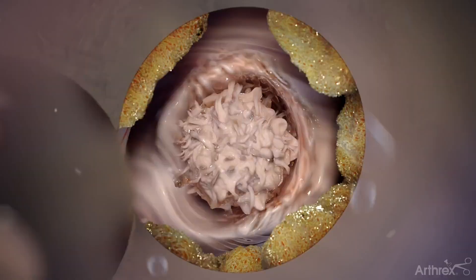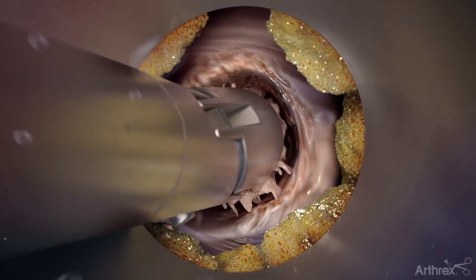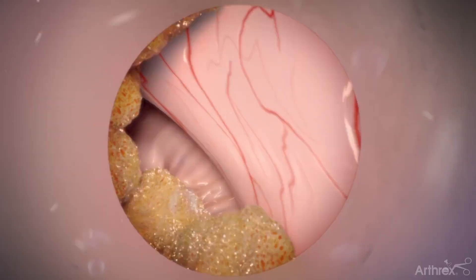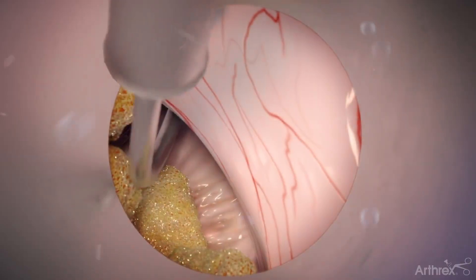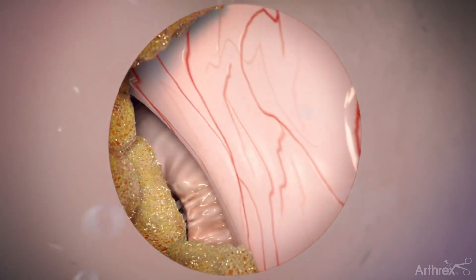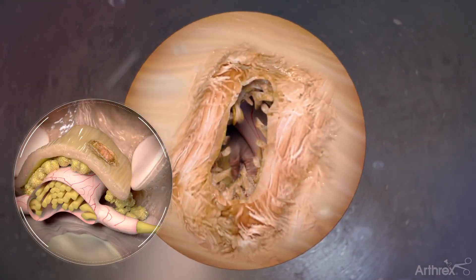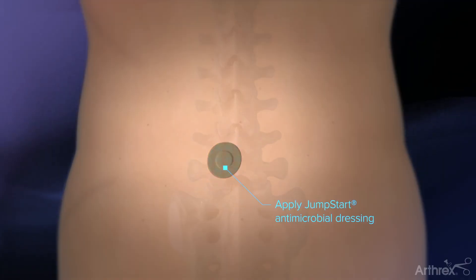Use grasping forceps to extract the exposed nuclear material. Use the electrosurgery probe to ablate nuclear material and minimize the annular defect. The ball tip probe is used to ensure a free and mobile nerve root, with no remaining disc fragments encroaching the nerve. Once complete, slowly remove the scope and cannula, and apply a jumpstart dressing to the incision site.